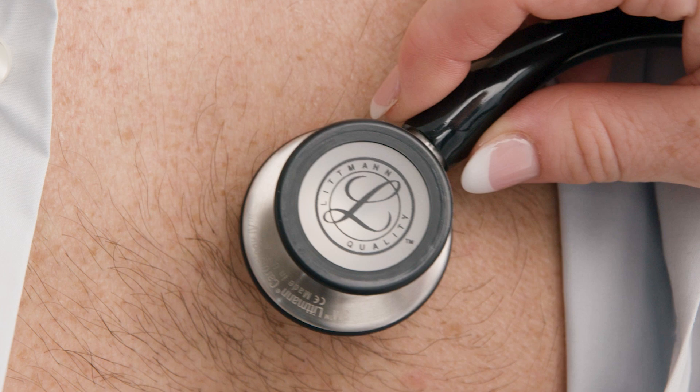All of these parts crafted with precision are why Littmann stethoscopes are trusted for excellent acoustics and reliability.